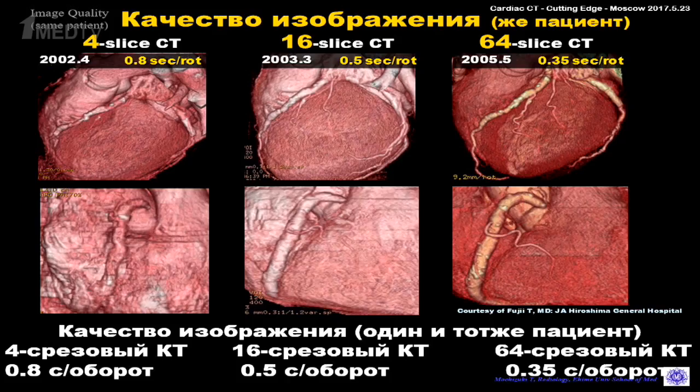So I want to present the development of the image quality. This is the 4 slice, 16 slice, and 64 slice CT of the same patient. So you can recognize the difference of the image quality.